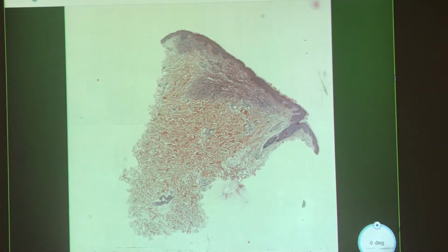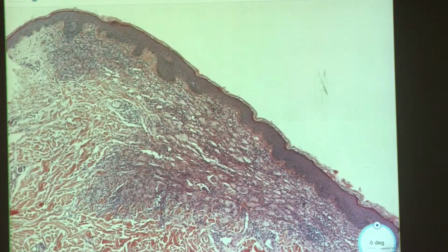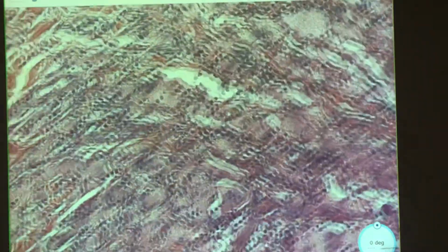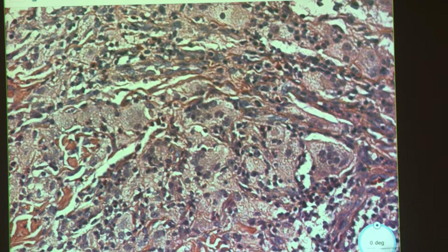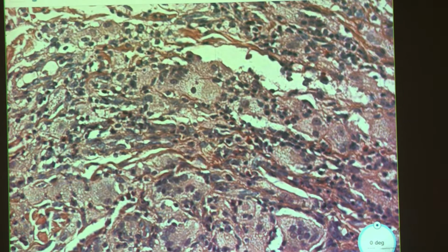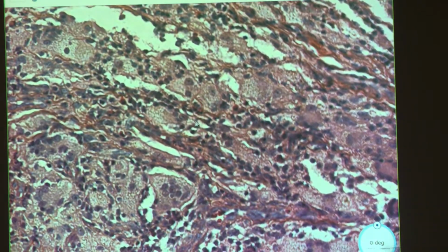And this is our slide. Okay, we have skin. Remember to speak up. We have skin and some subcutaneous tissue here. This part seems a little expanded. Yes, this region. Oh, okay. There's a lot of these foamy cells here. Kind of macrophages, probably of some sort, but definitely probably lipid-laden macrophages. I love it. Yeah, absolutely. Perfect.